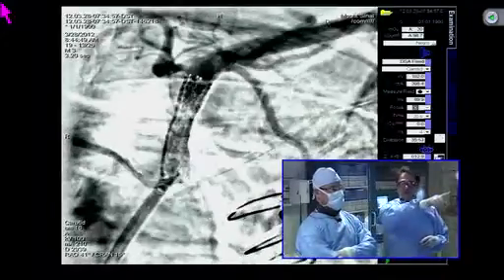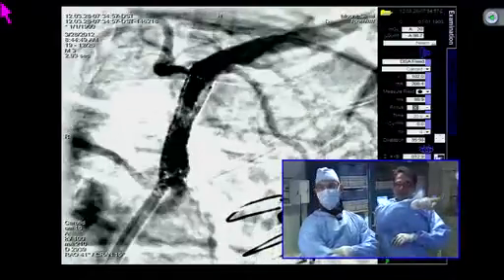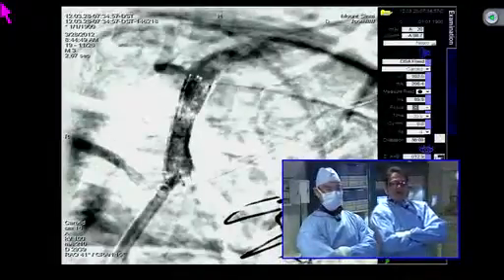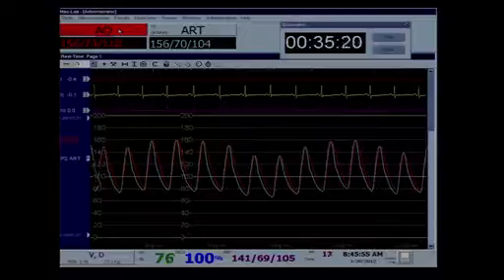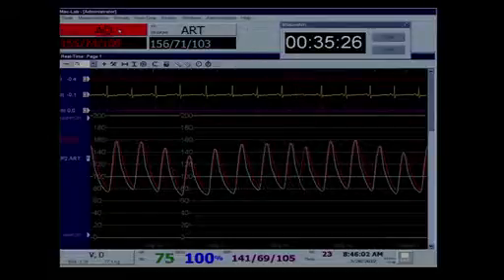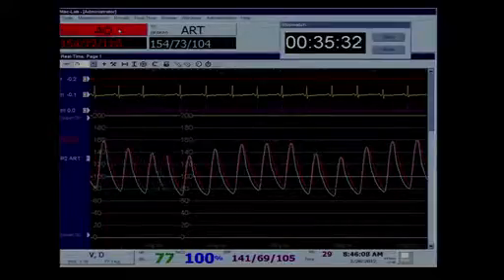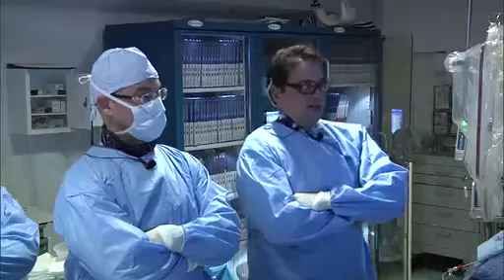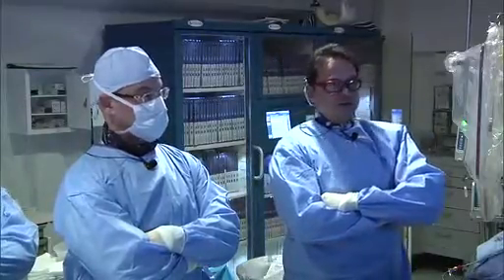Now, if you can show the dual transducers on the screen, we're asking our cameraman here to just show the screen. And can you show the screen, guys? And the hemodynamics. There you go, we got it now. We actually have both the transducers, the red being in the aorta and the white being in the distal subclavian. And you can see here, because of her sedation and other things, she has absolutely no gradient across this subclavian artery. So, having done this, having quality 2 projections showing what it is, the fact that she had pain, and the fact that post-dilating it may actually cause harm, I think what we're going to do here is probably call it quits, George.